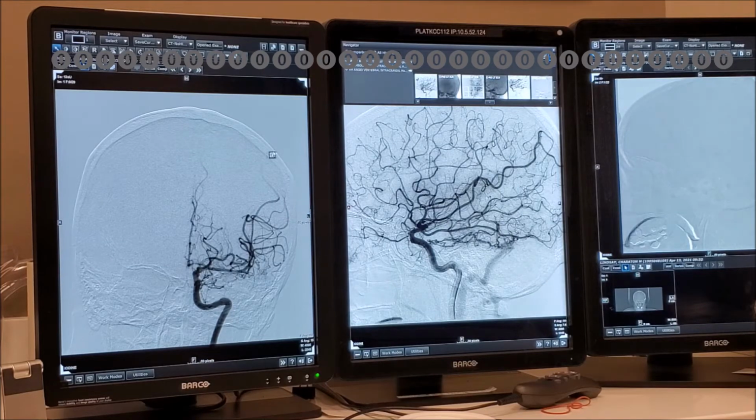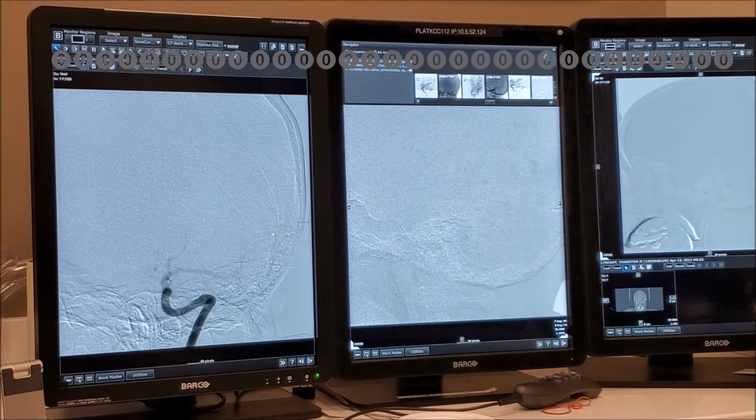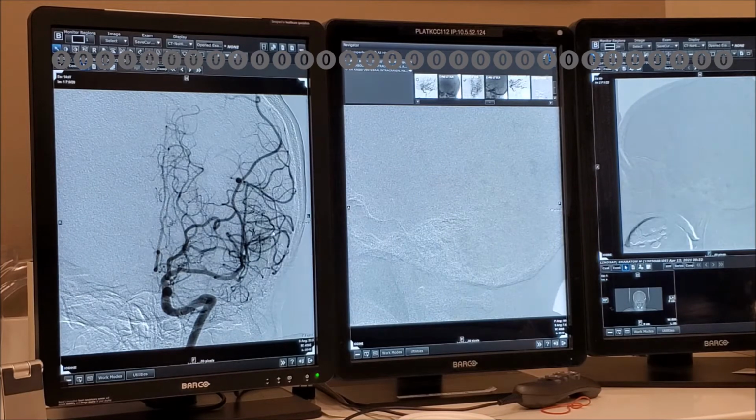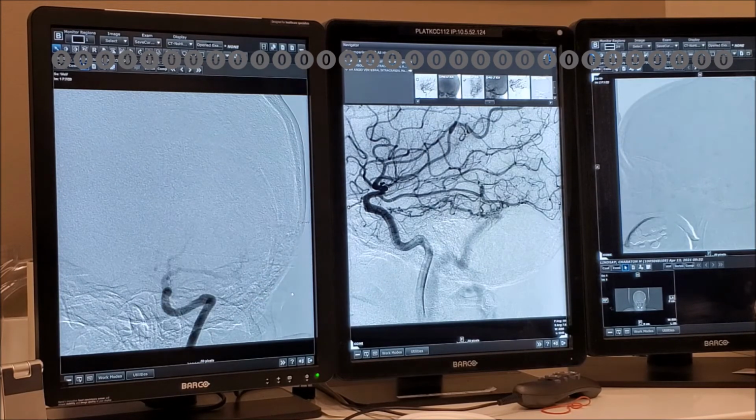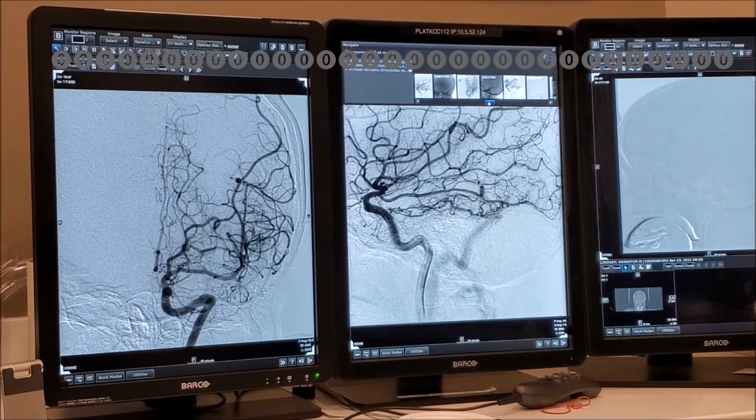Okay, so you did an oblique. Who did this, Angel? That was me. Why did you repeat this injection? To focus firstly on the lateral and the fistula point itself, but on the A plane, more of a Townes projection to look at the transverse sinus drainage. Okay. Did it help you? There's also dominant MCA. It didn't help me. That's okay. What we do know is that this sinus is not thrombosed, at least not from here down, and it's not draining to cortical veins, right? Yes.